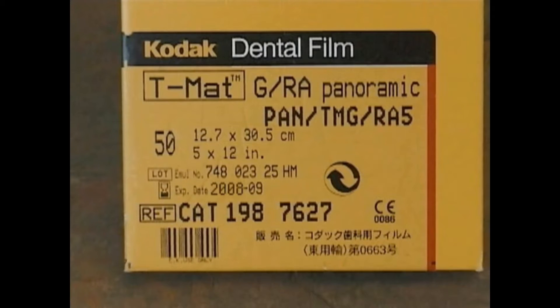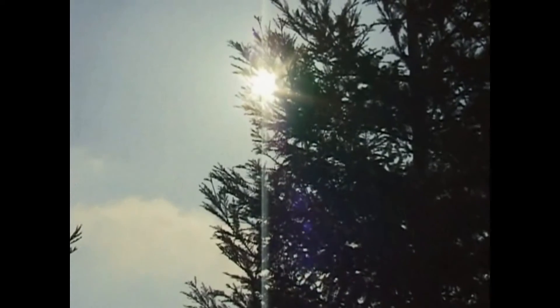Though machines vary, a panoramic x-ray only adds about as much radiation as you'd get in 10 days from natural sources, such as sunlight, minerals in the soil, home appliances, and outer space.